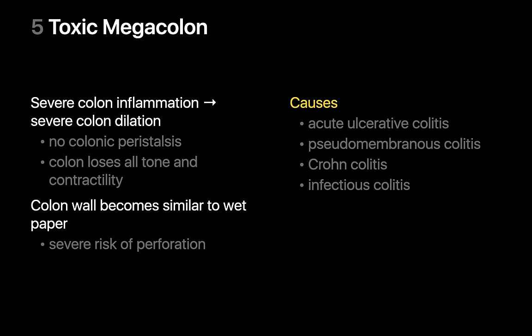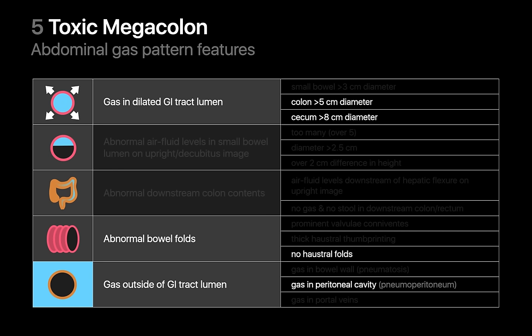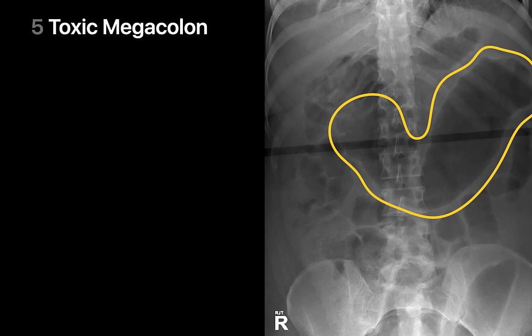Toxic megacolon is a complication that can occur in the setting of severe colon inflammation or infection, resulting in complete loss of the colon's neurogenic tone. With loss of neurogenic tone, severe colonic dilation develops with the risk of perforation. X-ray findings are severe colon distension and loss of haustral folds — dilation of the transverse colon can be as great as 15 centimeters in diameter. In this example, the transverse colon is gas-filled, severely dilated, and relatively featureless as all the haustral folds are absent.